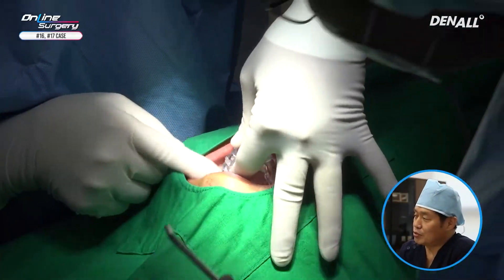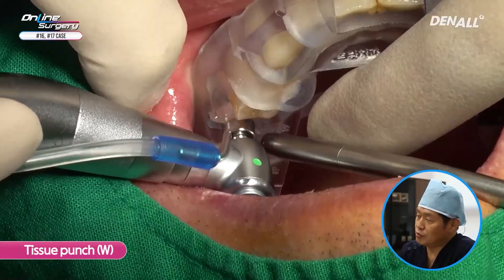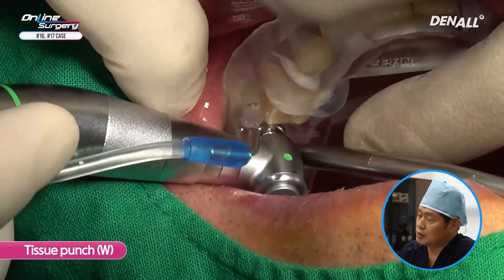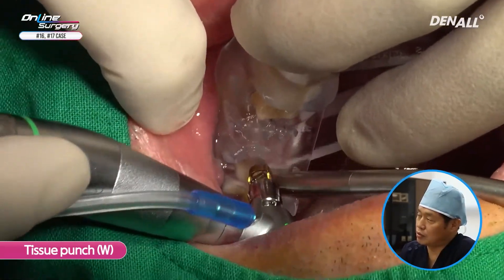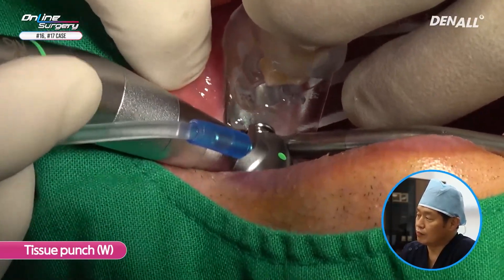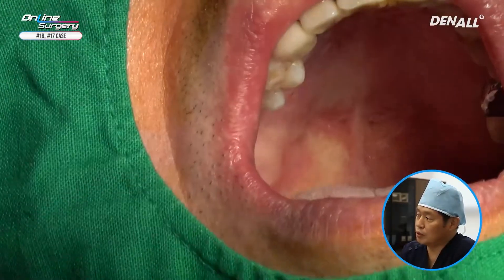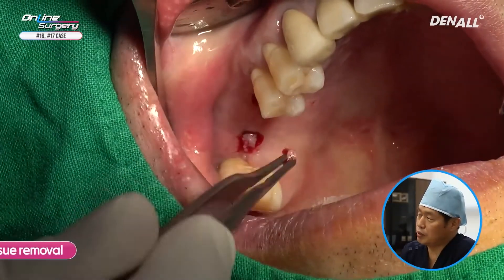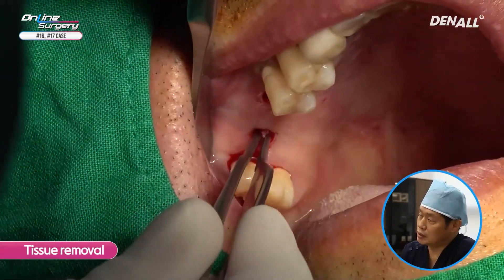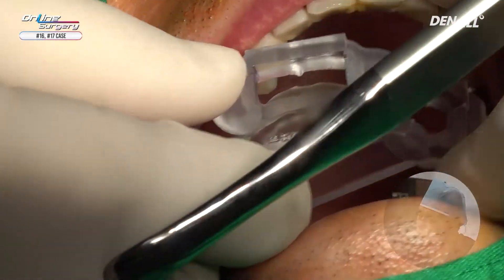One guide template is adapted. Attached gingiva was sufficient in this case and flapless surgery was done. Tissue punch was done to punch the gingiva. You can see that gingiva may not be removed thoroughly, so the template was removed and tissue is removed. After that, subsequent drilling is going to be done.